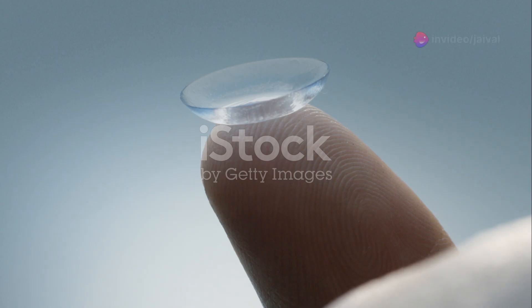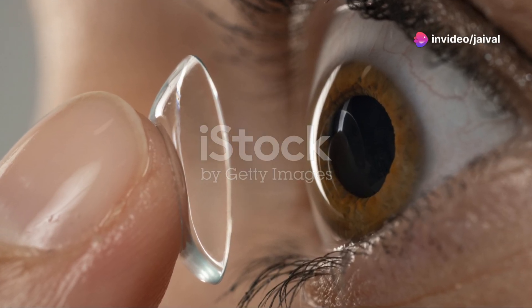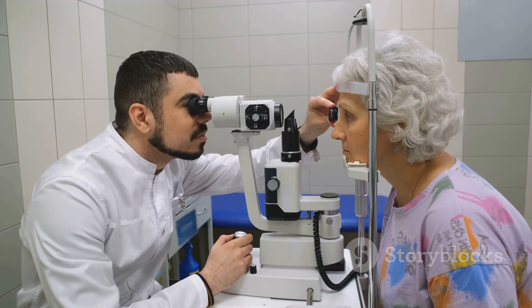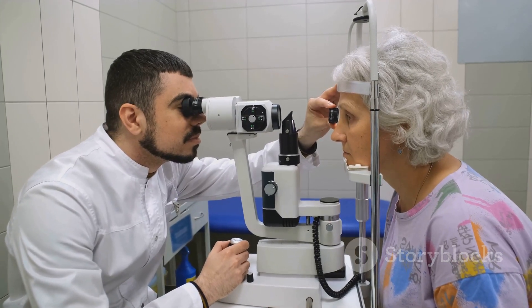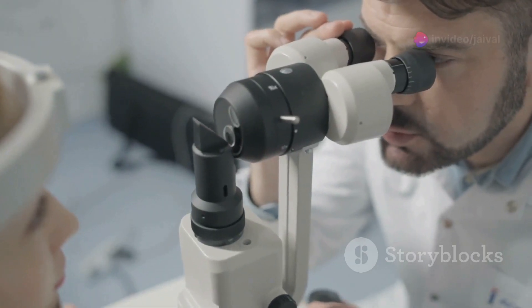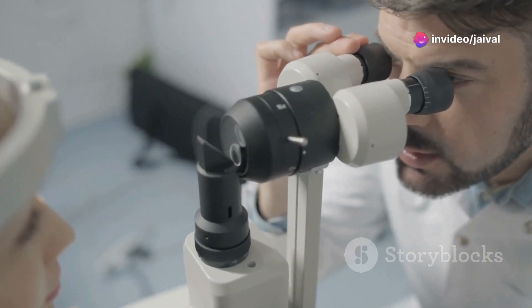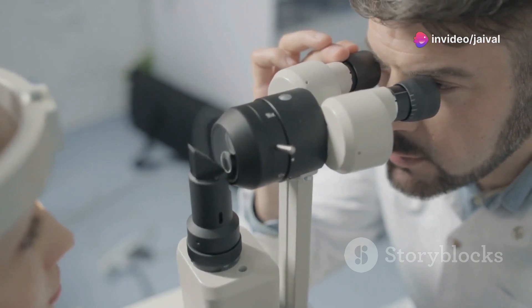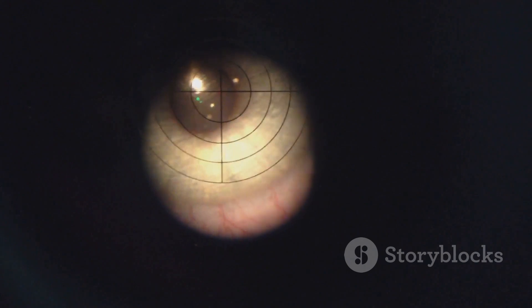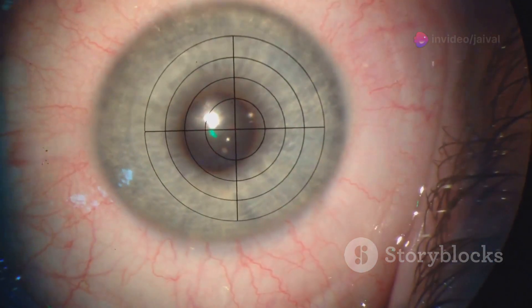The goniolens, a specialized contact lens, is a crucial tool in the field of ophthalmology. It is key for performing gonioscopy, a procedure that allows eye care professionals to examine the anterior chamber angle of the eye. By neutralizing the corneal curvature, the goniolens provides a clear view of the iridocorneal angle, which is essential for diagnosing various eye conditions. This visualization is critical for assessing the drainage angle of the eye, which can reveal important information about the patient's ocular health.